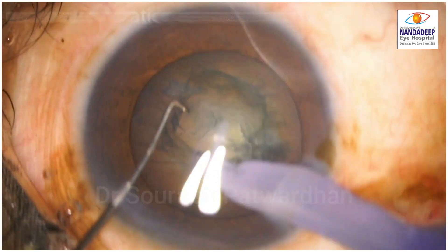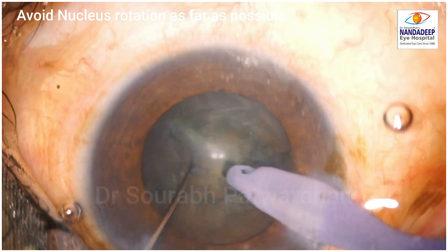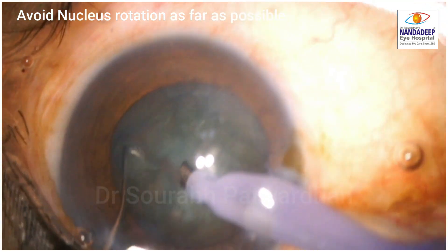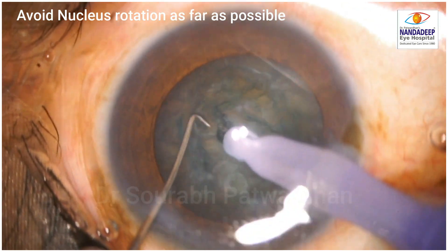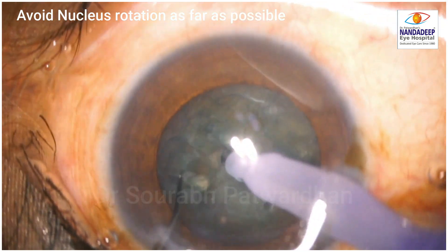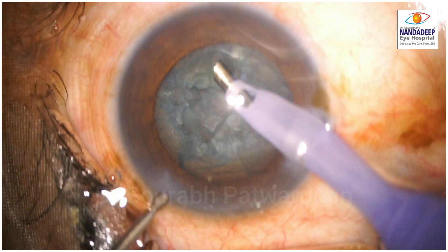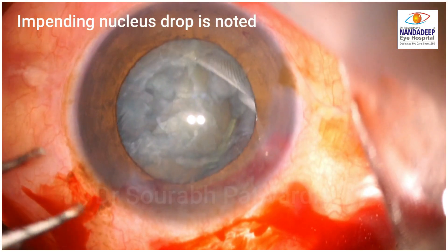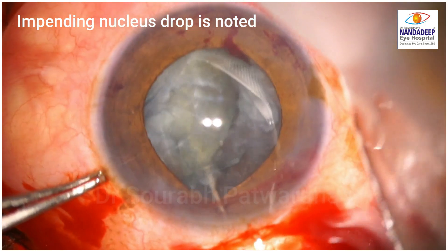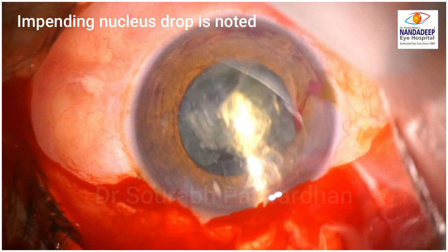Nucleus rotation is also preferably avoided, as the weakened posterior capsule might rupture and open. If it opens, many times we find the nucleus is tilting, as the PC has given way. You can see here that after nucleus rotation the nucleus starts tilting to one side, indicating the posterior capsule has now opened, and we may have to convert such a case to small incision cataract surgery to deliver the nucleus.